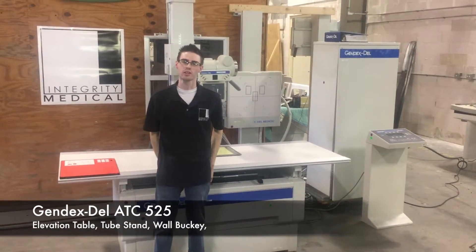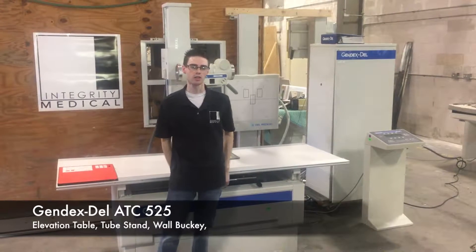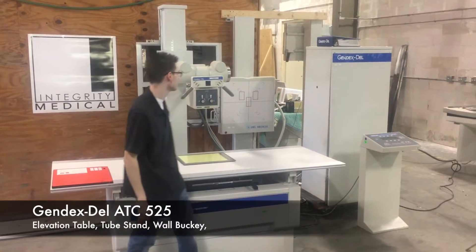Hi, my name is Andrew and this is Integrity Medical Systems. Today we are going to show you the Gendex ATC525.